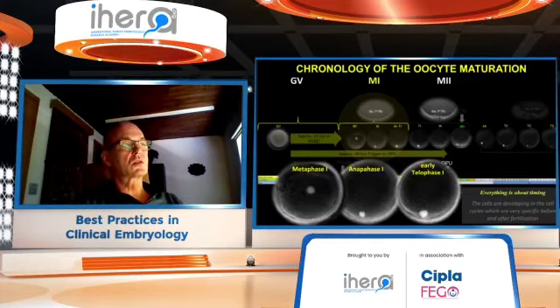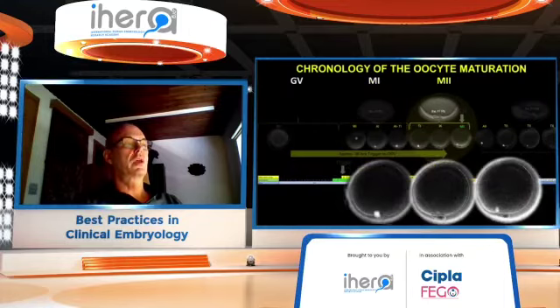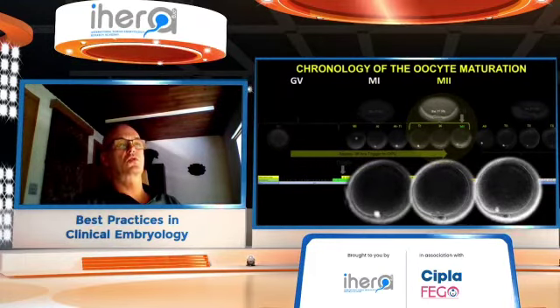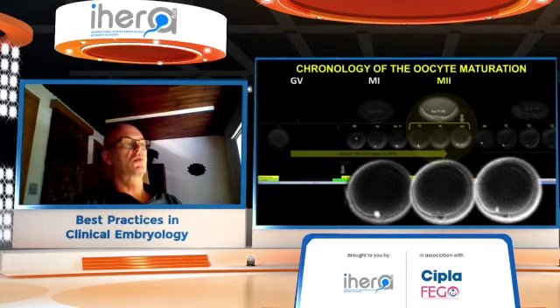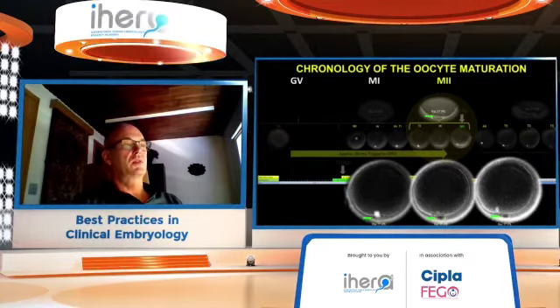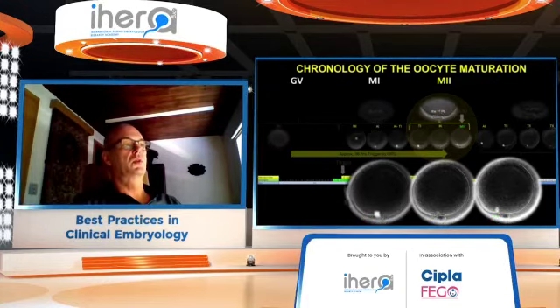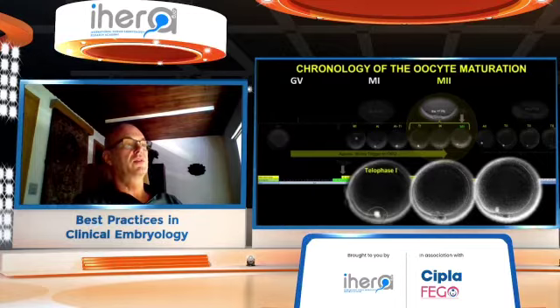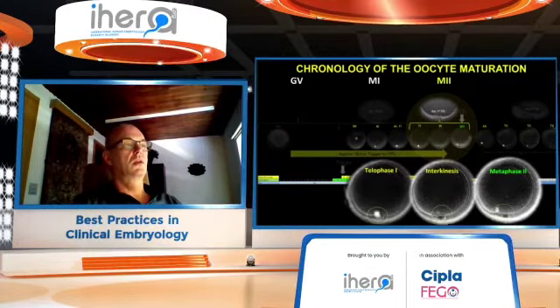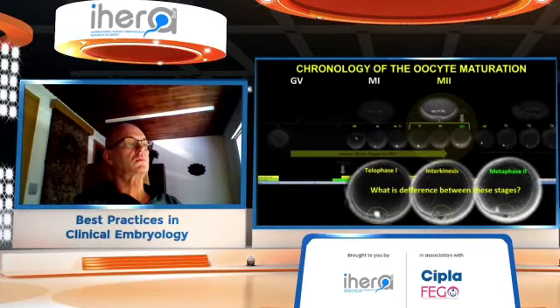Now let's go back to the oocytes, because even in so-called M2 oocytes, we can see different pictures under polarized microscopy when compared with conventional. The first polar body is visible in both microscopes, but polarized microscopy can reveal telophase, interkinesis, and the real metaphase 2 oocytes. What is the difference between these stages?